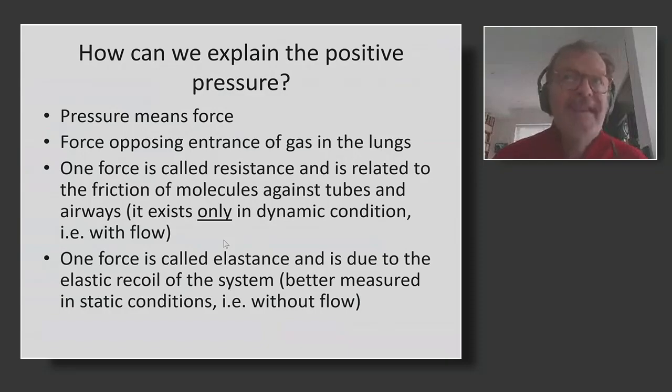If you're in static conditions, you have no resistance, because resistance is really what's impeding the entry of gas in a dynamic way. The other force is the elasticity of the system, which we can call elastance or compliance. But remember, this is the elastic recoil of the system, like a balloon, and it's better measured in static condition.